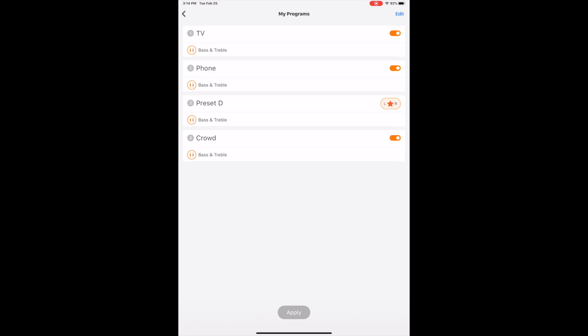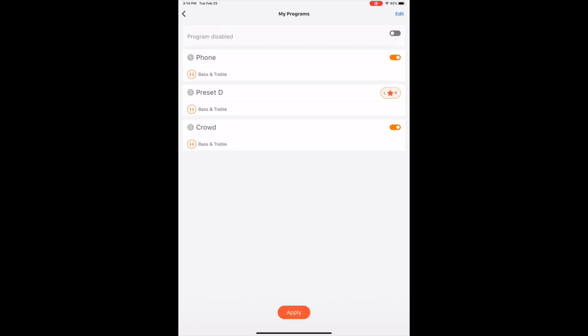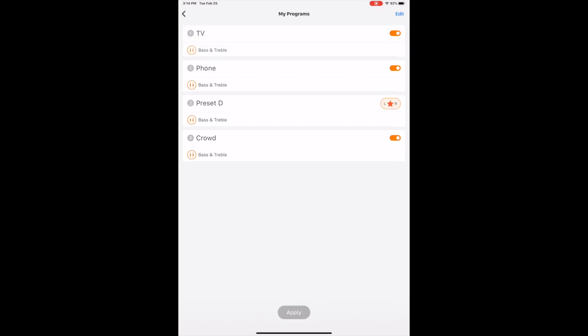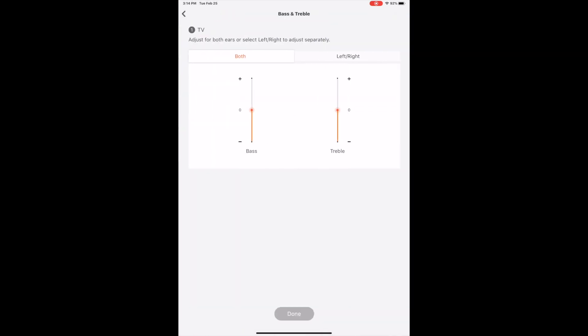So they've really done a phenomenal job with this. But what you can also do is you can also turn on or off particular programs. So if you only want two or three programs, you have that capability of doing it.